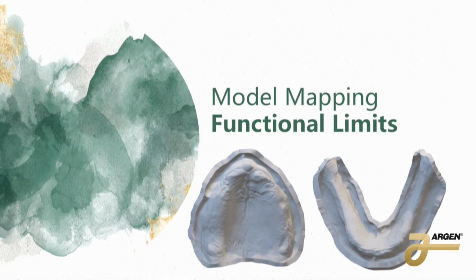So functional limits. This is extremely important when we're setting teeth. I'm not going to get into posterior setups or anterior setups in crazy depth.